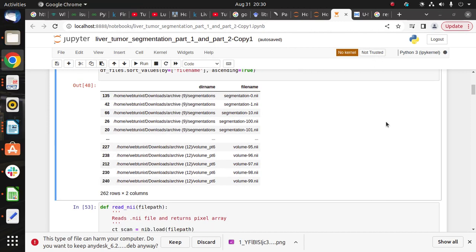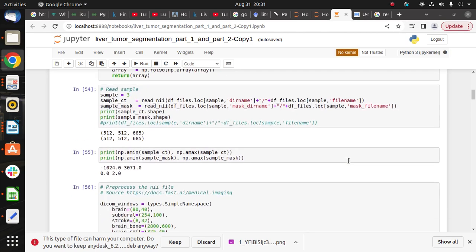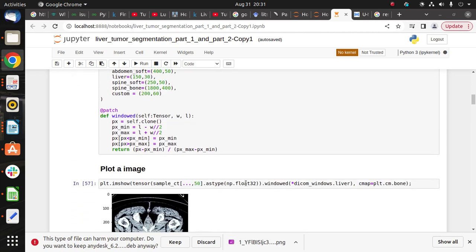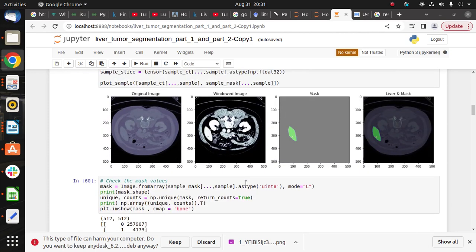We do data preprocessing. For preprocessing we use NumPy, Pandas, and the NiBabel library. By using the NiBabel library we are able to convert the nii file into NumPy. After that we read the nii files and read some samples.